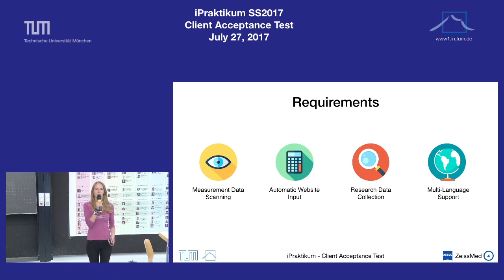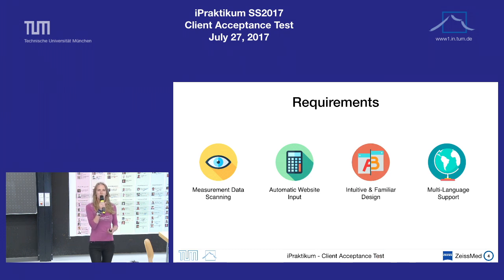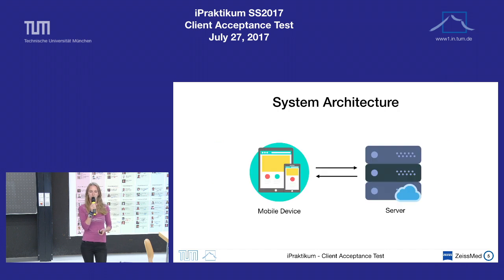We take a picture of the printout, so we had to find a way to transform all this data to an electronic form we can use. Second, our website didn't provide any kind of API, so we had to find another way to input values and get a response. Third, our customers were already adjusted to the website, so we had to build a nice intuitive UI that is also familiar to the existing website. And finally, this is a medical application, so all the information had to be very accurate.